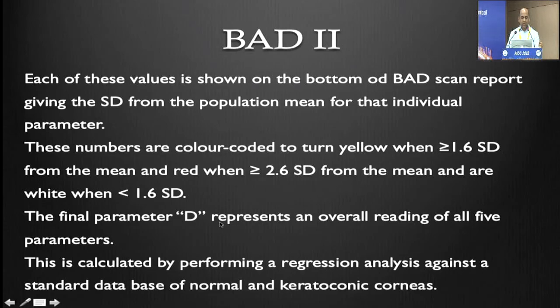The final parameter D represents an overall reading of all these 5 parameters, and it is calculated by regression analysis, which the software does.